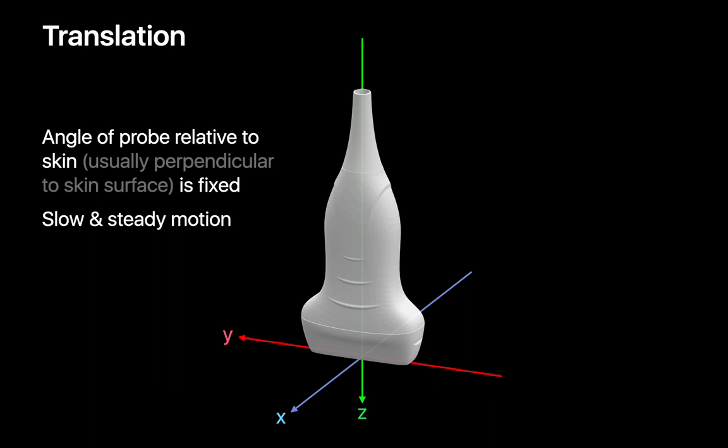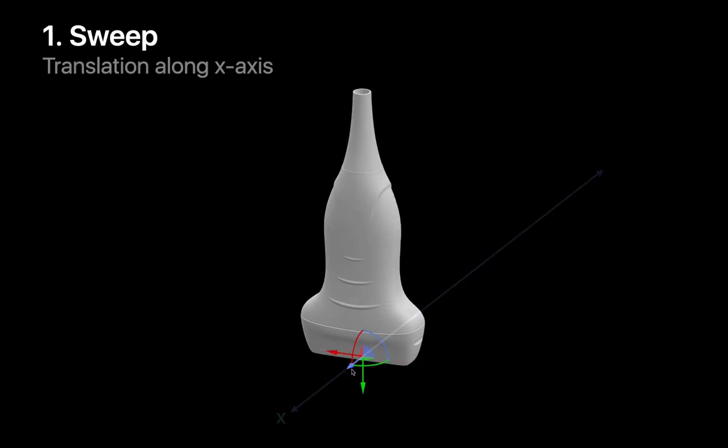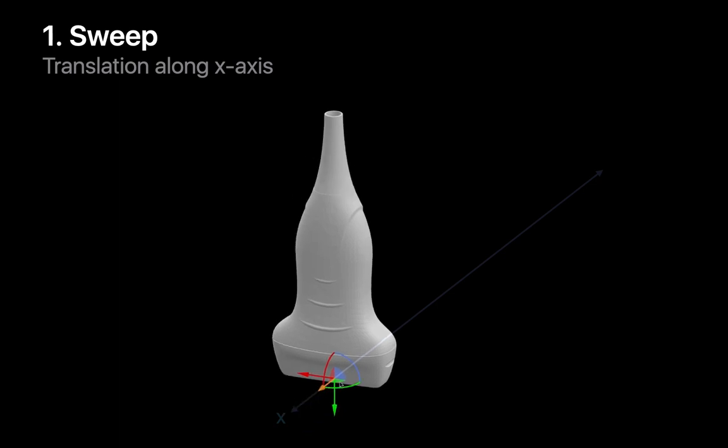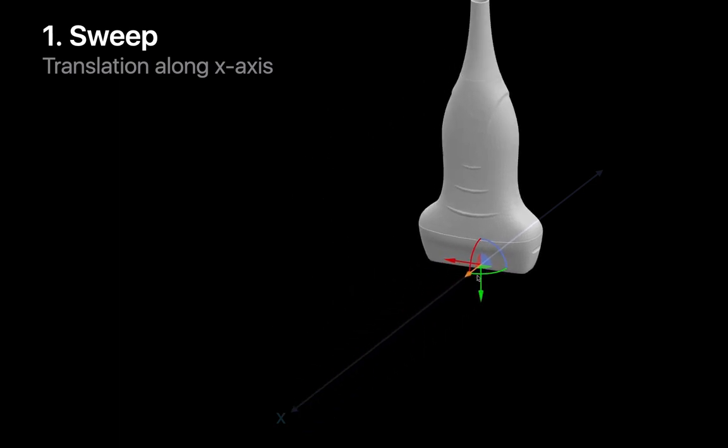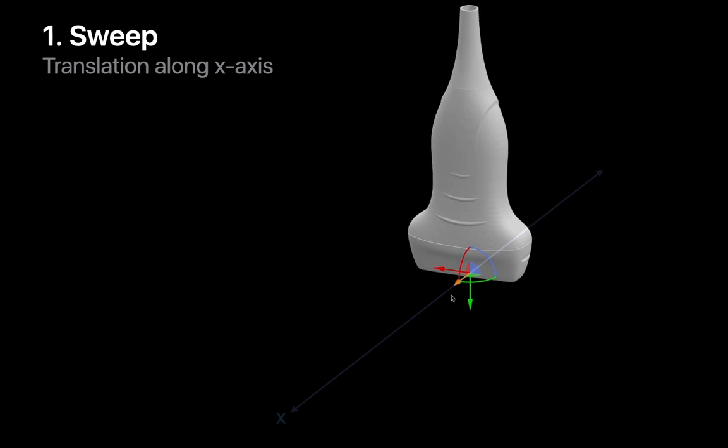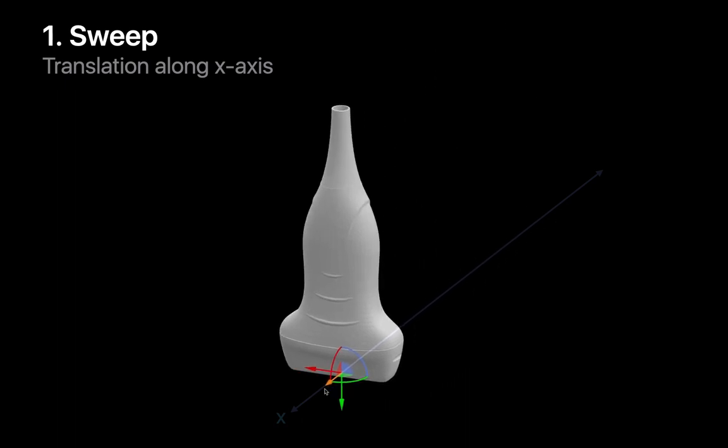When translating the probe, the angle of the probe relative to the skin is usually perpendicular and fixed throughout the motion. The translation motion is usually performed in a slow and steady way. Here's an example of what sweeping with a probe looks like as the probe head translates along the x-axis while its angle relative to the skin surface remains perpendicular and fixed.